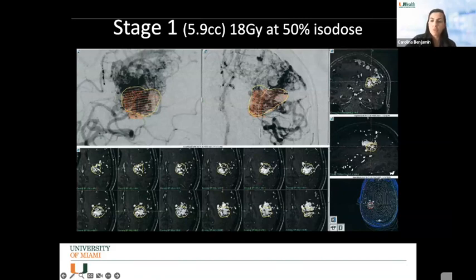My preference is, AVMs often have this cone shape here. I tend to treat the deeper locations first, because it provides me a sense of safety that perhaps what could be the more dangerous area in terms of a hemorrhage risk, if I treat that first, then I'm a little bit safer. I've protected the patient a little bit.